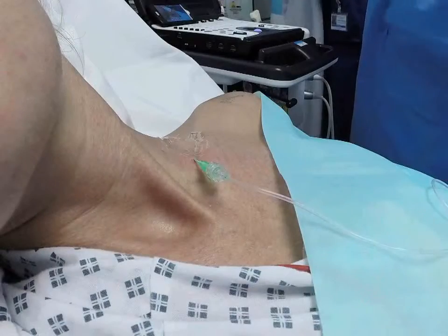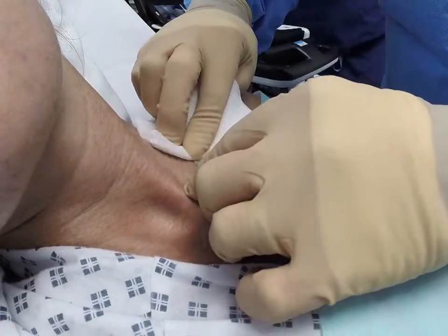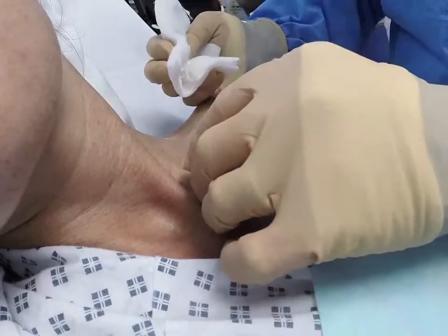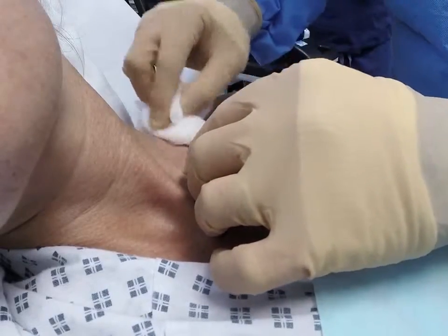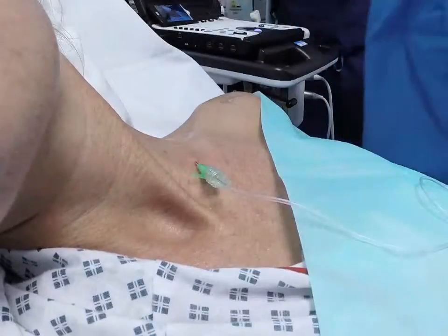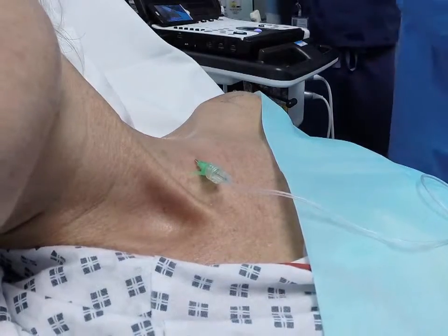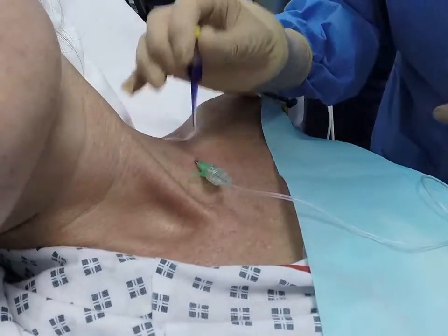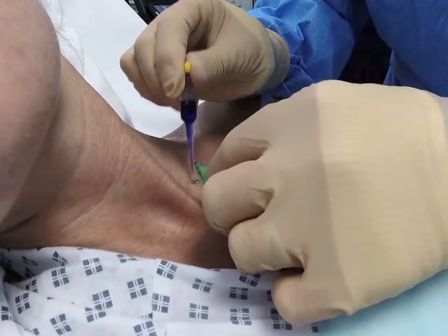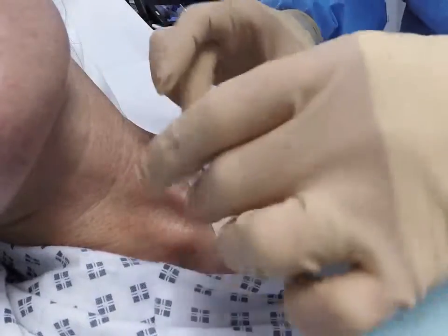The catheter is then secured in the usual fashion using tissue adhesive, stereostrips and tegaderm as here, or using Pajunk's own fixation device, the FixerCath, and we've made a separate video of that to show you how that works.